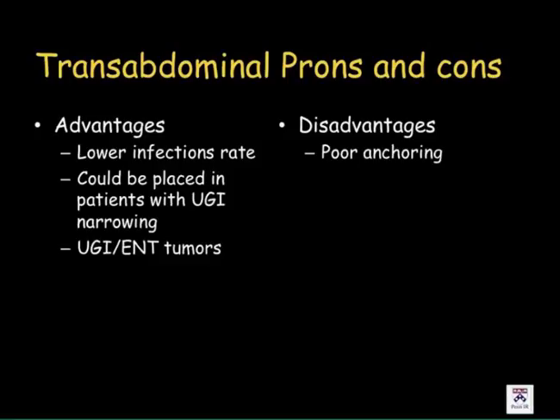It's enough to take a 5 French catheter, and using the wire, you can negotiate the severe narrowing and put this 5 French catheter in the stomach. More than that, if you have complete occlusion of the upper GI tract, and you cannot put your gastrostomy or NG tube to inflate the stomach, you actually can use ultrasound and fluoroscopy, and put a 21 gauge needle inside the stomach. If it's filled with air, you use fluoroscopy. If it's filled with water, you don't see it on fluoroscopy, so you use ultrasound. Put this needle in, inflate the stomach through this needle, and complete the gastrostomy.